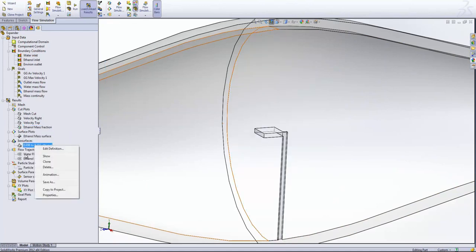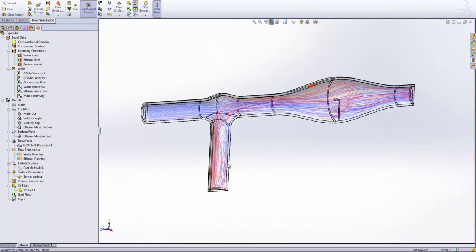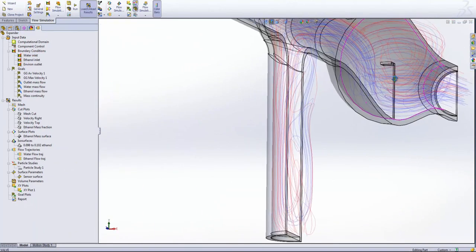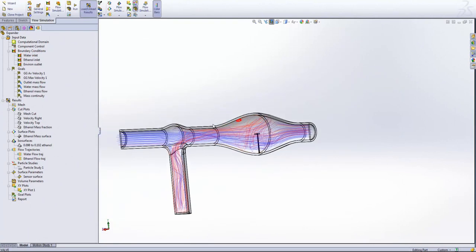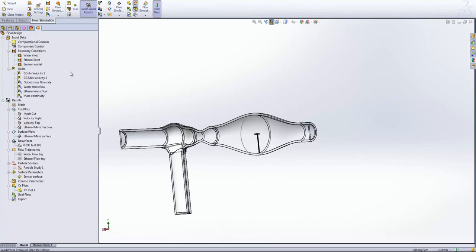So let's have a look at some of the other plots that we've generated for this. Here we can see the flow trajectories, so we can see still how the water is flowing back down that ethanol tube, but more importantly we can see how the ethanol is sticking up to this top surface and not interacting too much. We've got a void of red flow trajectories in this bottom area, which tells me that the flow is still sticking to the roof of that section. So by my reckoning, I'm not happy with this design. I'm going to make another change. So let's jump over to my final design and we'll have a look at the changes we've made.